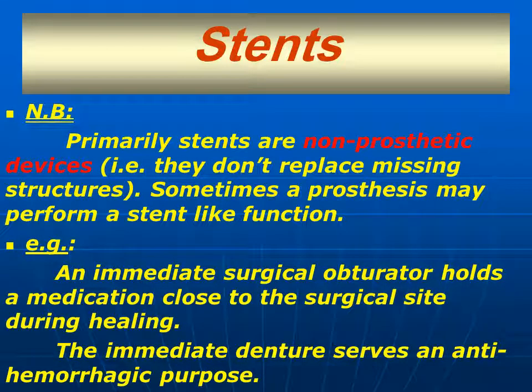It has to be noted that primarily stents are non-prosthetic devices. That's to say, they do not replace missing structures. However, sometimes a prosthesis may perform a stent-like function. Sometimes the prosthesis will act like a stent. How?